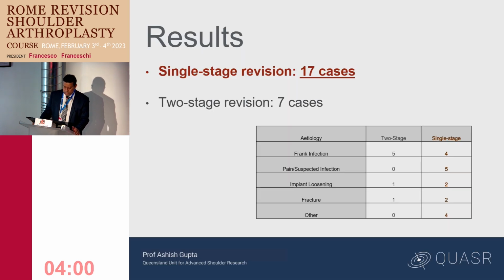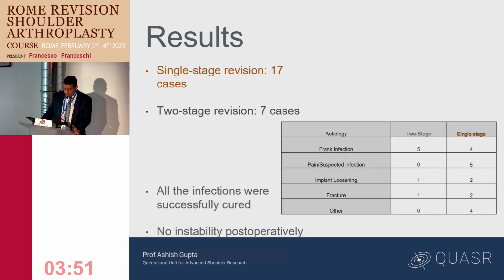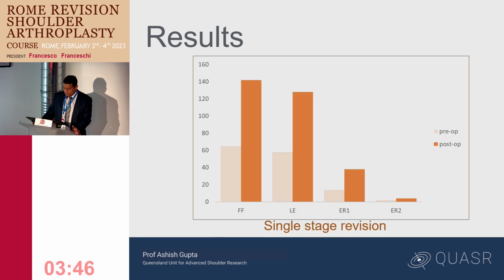So I'll talk about my results. We've done like 25 cases in a single stage now. This is a slightly older slide. And out of these 17 cases, this is the spread. And all the infections were successfully cured, and I haven't had any instability till date.